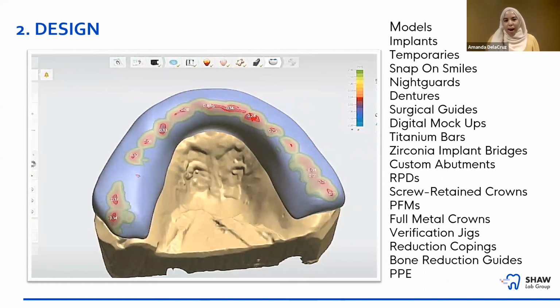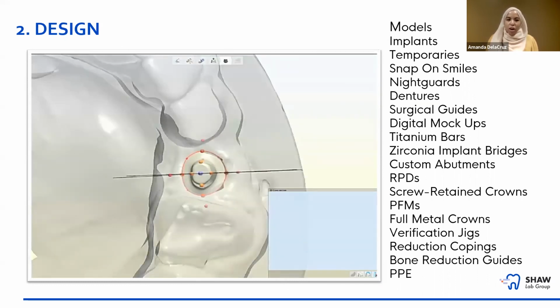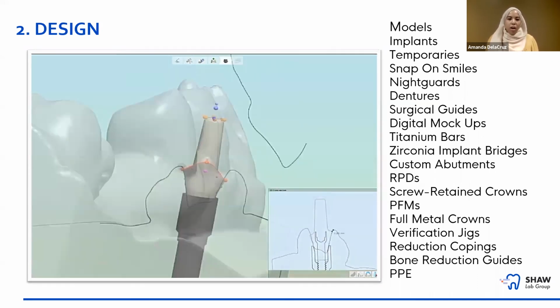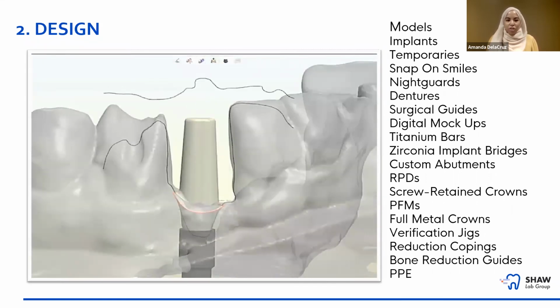And the next one we have is a titanium custom abutment. So when we do custom abutments, there's a lot of thought as well. We're trying to make the most ideal substructure, trying to put an ideal emergence profile, being subgingival 1 millimeter, making sure it's the right height, anti-rotational. There's a lot of considerations when we do that. You want to make sure it's very, very strong.